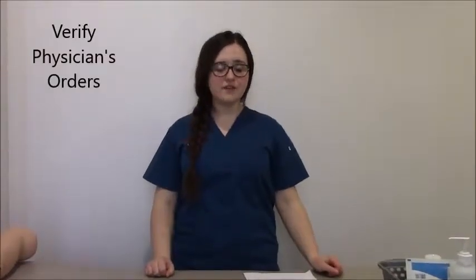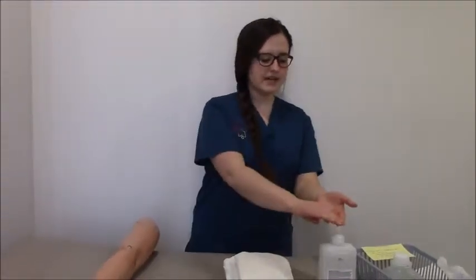Today I will be demonstrating my skill in wound assessment and dry gauze dressing change. So verify your physician's orders. For Mr. Mancini, the orders are to clean the wound with normal saline 2 times a day and to apply a dry gauze dressing. Perform hand hygiene.